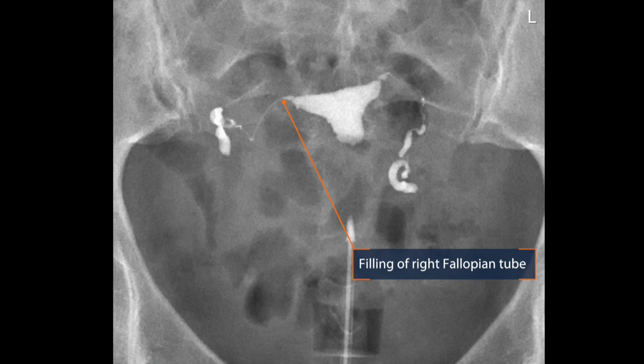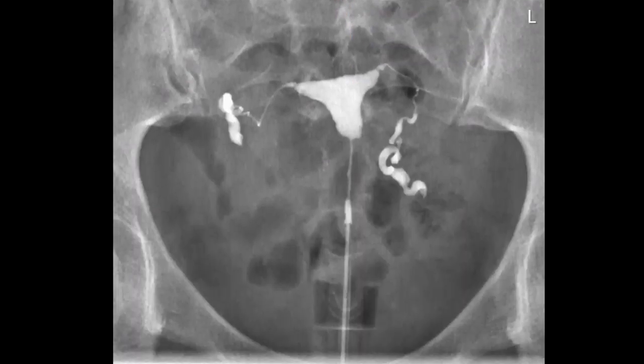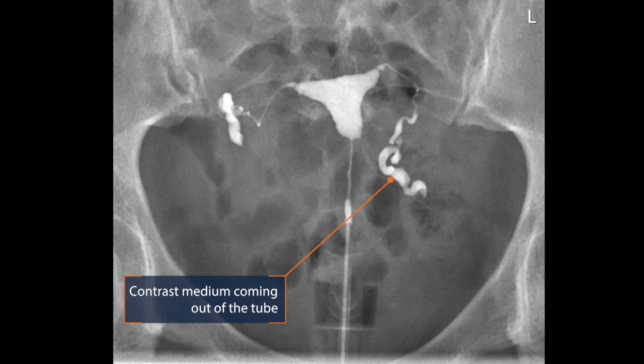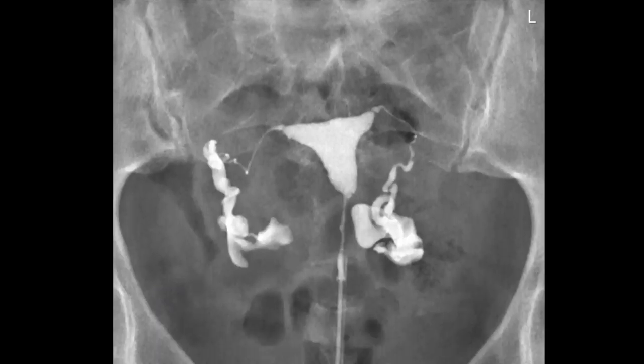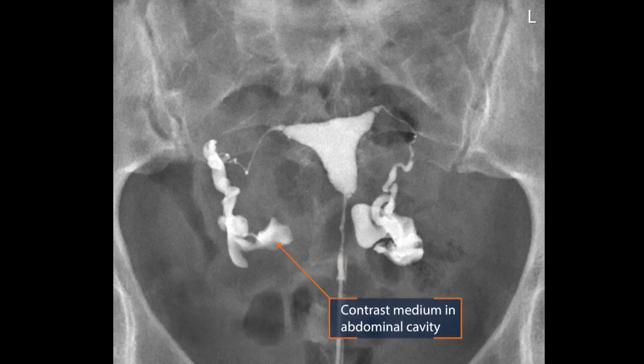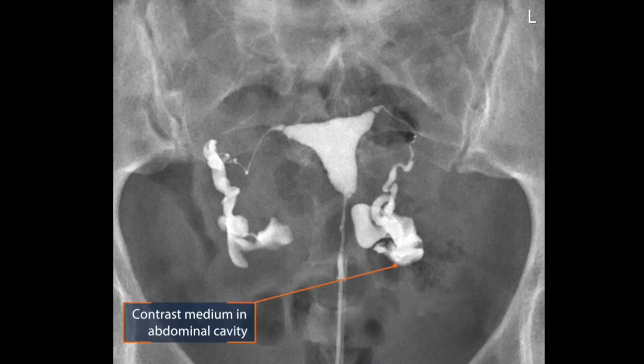This is the right tube of the patient. It is also filled with contrast medium until the end of the fallopian tube. Over here you can already see some contrast medium coming out of the left fallopian tube, and it will stream into the abdominal cavity. So at this picture we can see that the left tube is open. And at this picture you can see that both tubes are open. Also at the right side you can see that the contrast medium is coming into the abdominal cavity, and on the left side it is even more.